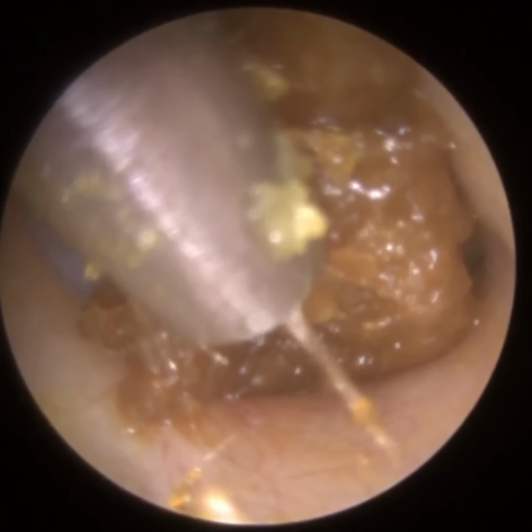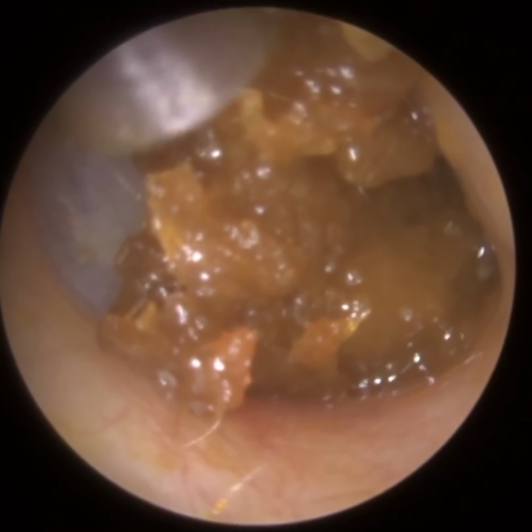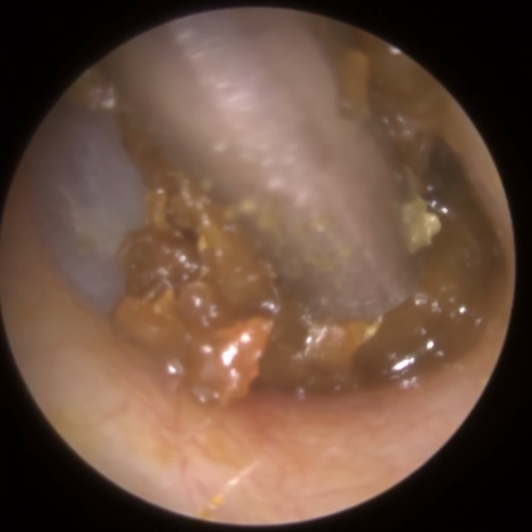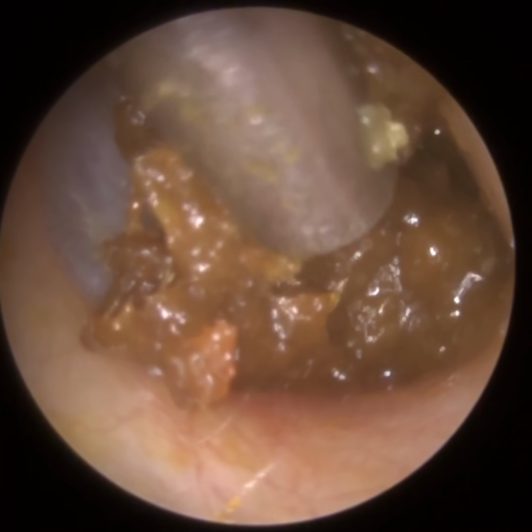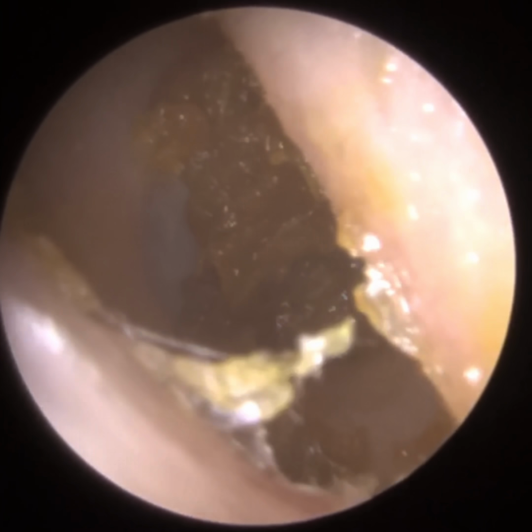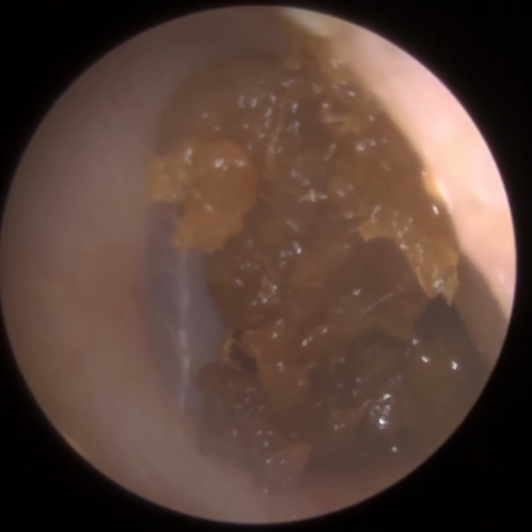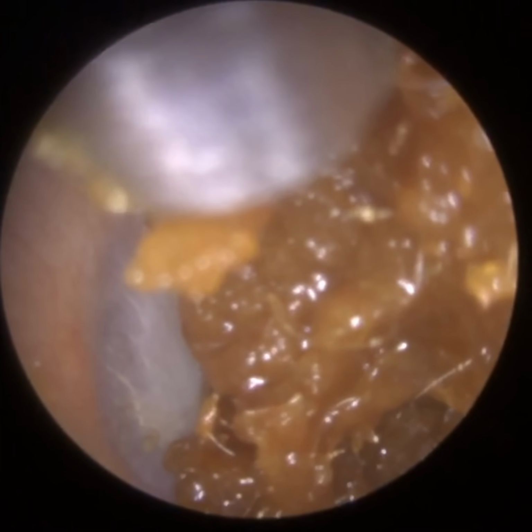So again, the wax is a bit soggy, it's the best description I can give. Got to be careful not to penetrate too far in with the suction probe, because then the soft gooey wax can, just like I did there, block the suction probe. So you just almost want to kiss the surface of the wax, but you do need a bit of give, a bit of purchase as well to bring it outwards.